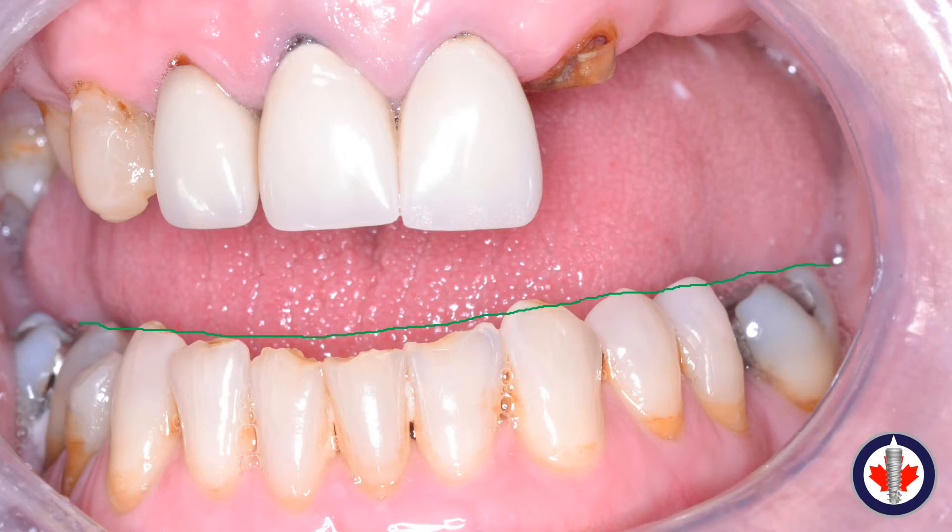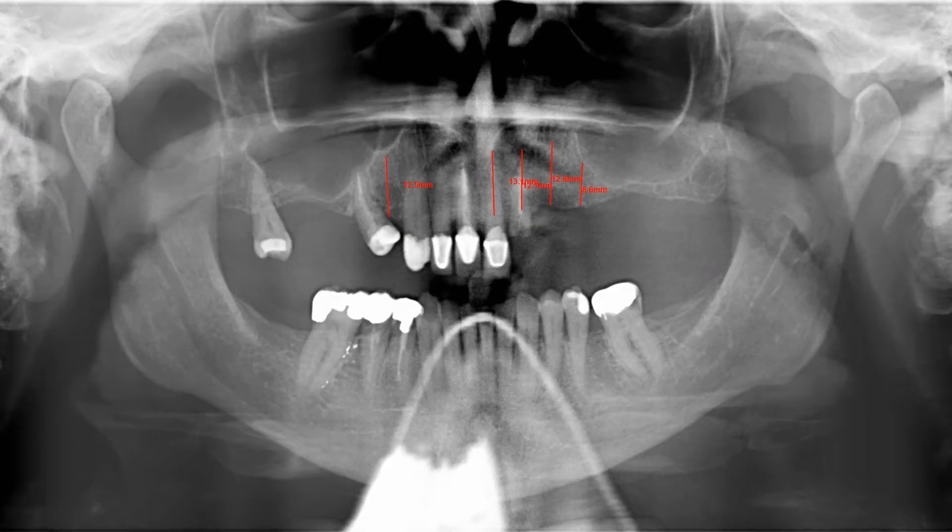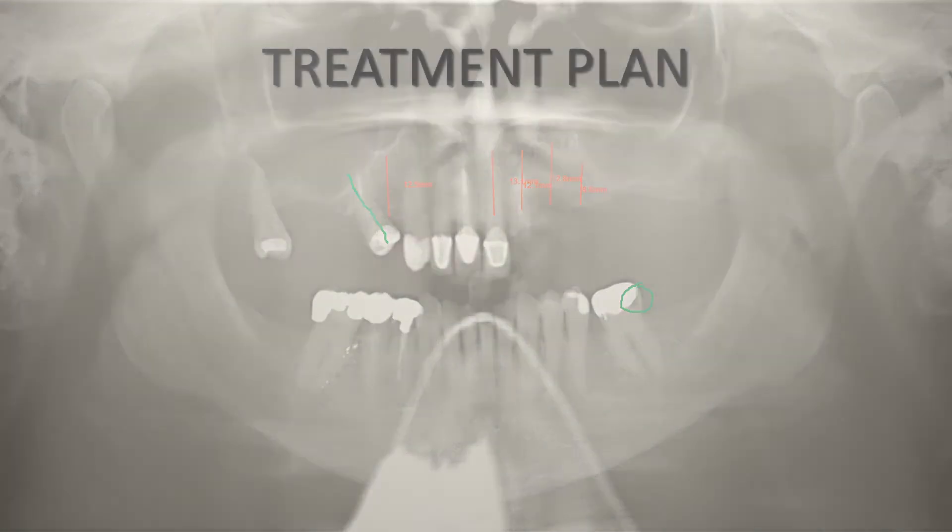There's also an edentulous spot for the upper right first premolar and some tipping on the maxillary upper right second premolar. On the panoramic radiograph, one can see the caries on the upper left central incisor and the upper left lateral incisor, and the stable arch that exists in the mandible, notwithstanding the caries on the lower left molar and some incisor wear on the mandibular anteriors.